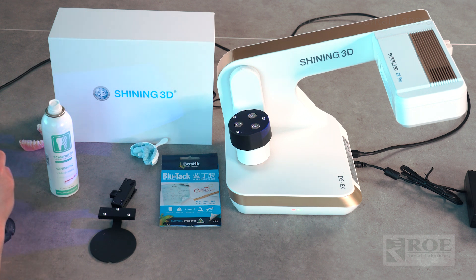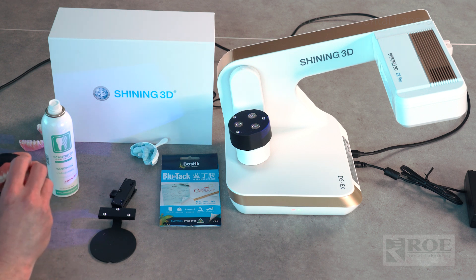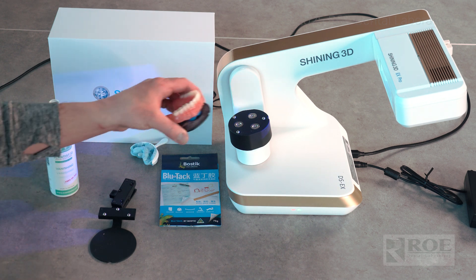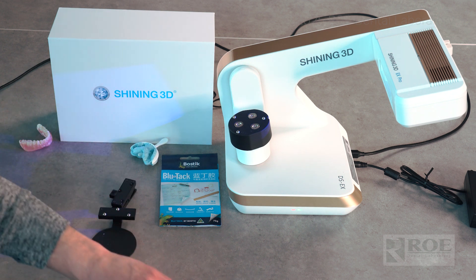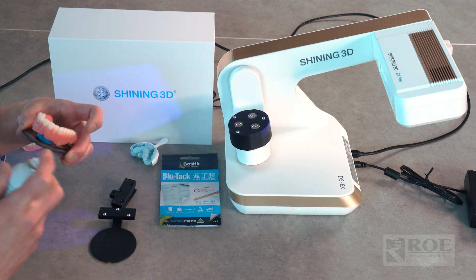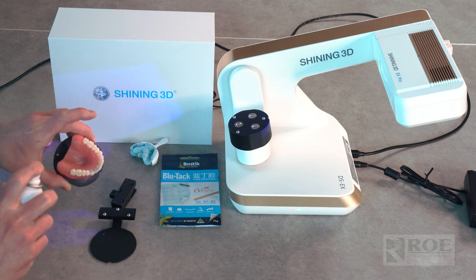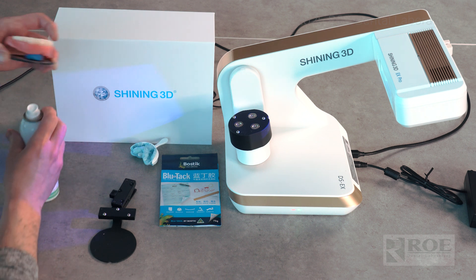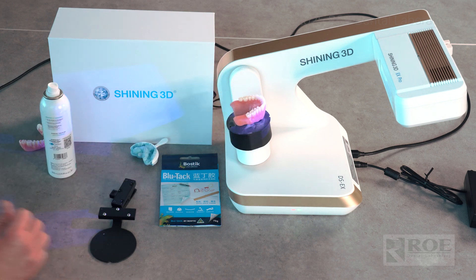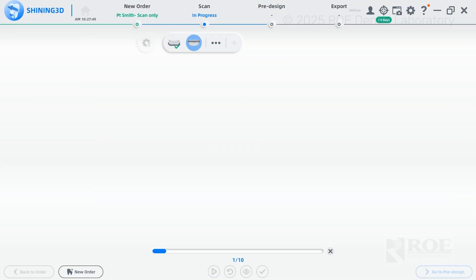Sometimes the powder makes it not stick. You'll be using rubber dams over this plate so you don't have to worry about sanitizing or autoclaving it. I'm going to use the spray. And we're good to start the scan.